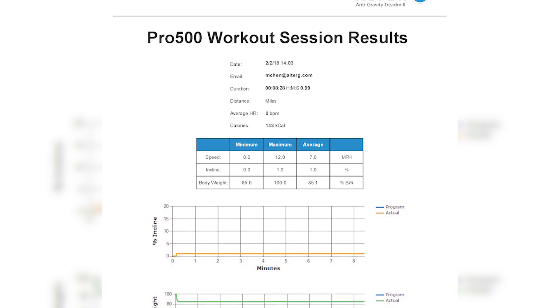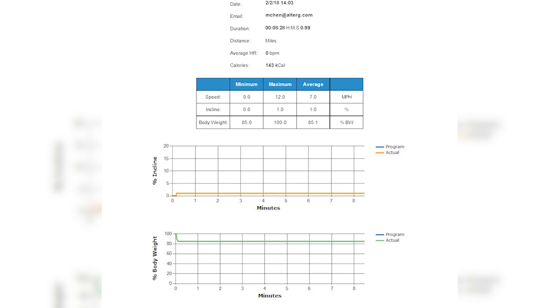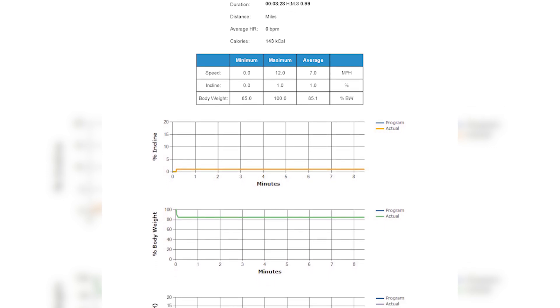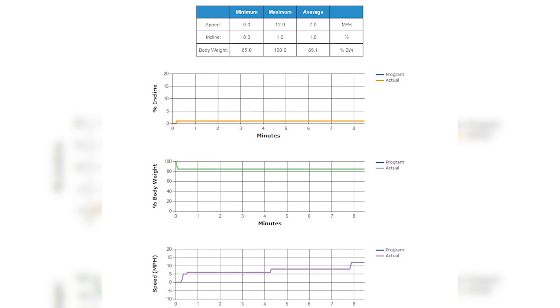The Pro 500's Stride Smart information can be recorded so athletes and their trainers have a record of where they've been and where they still need to go. Share reports with the athlete's entire training team for maximum efficiency.